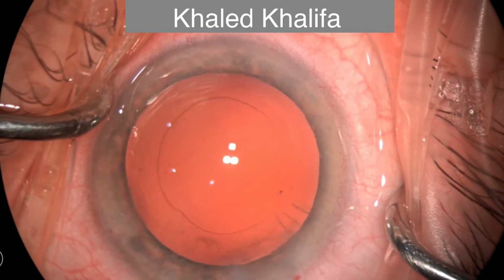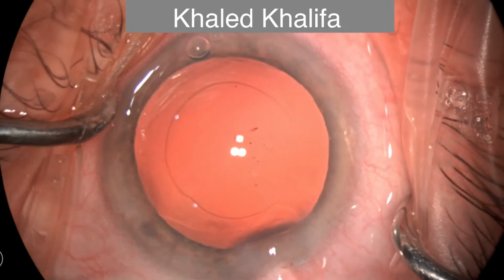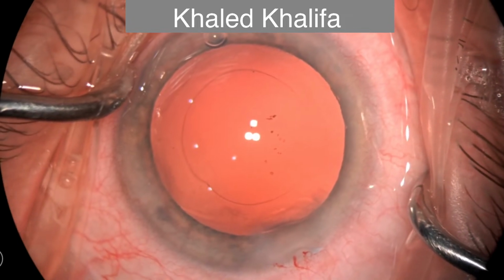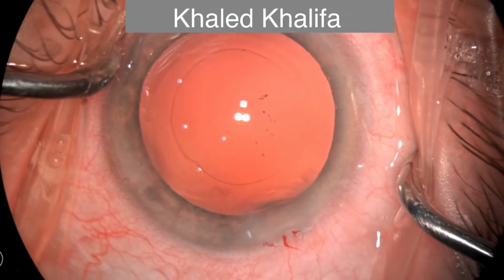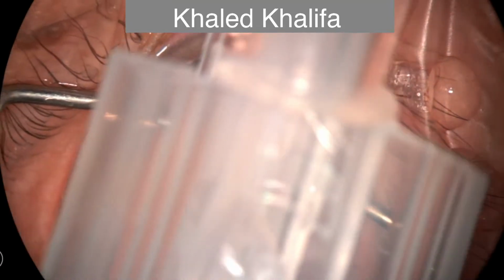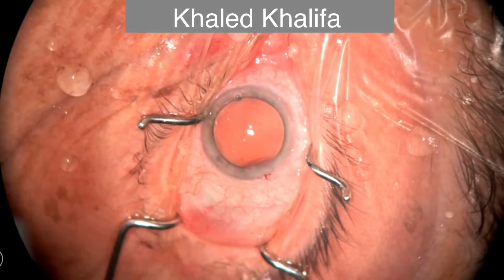Now this is a cohesive OVD into the bag, forming the bag and the anterior chamber as a preparation for implantation of the IOL. Now I'm going to inject a preloaded IOL, so that I'm hydrating the IOL first inside the cartridge.